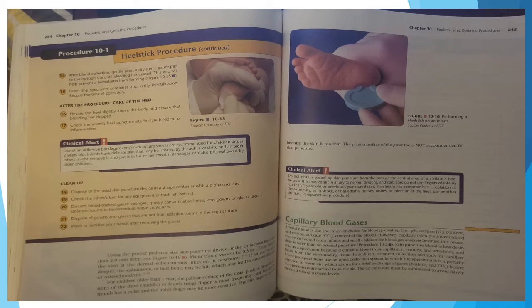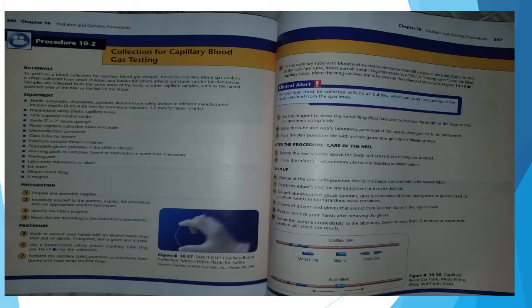In addition, common collection methods for capillary blood gas specimens use an open collection system in which the specimen is temporarily exposed to room air, which allows for a brief exchange of gases, both O2 and CO2, before the specimens are sealed from the air. The air exposure must be minimized to avoid falsely elevated blood oxygen levels.